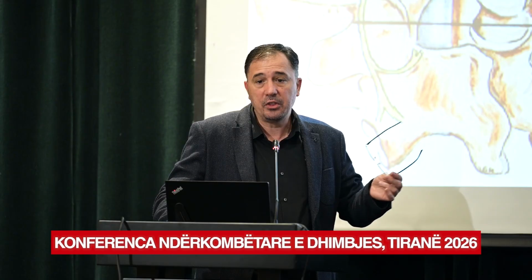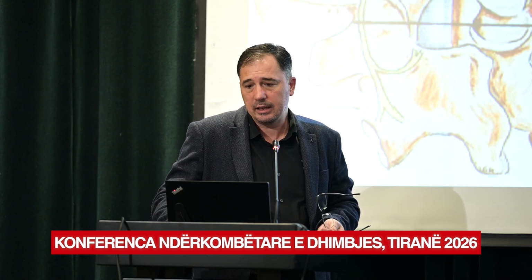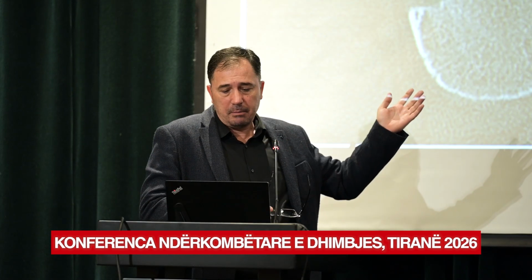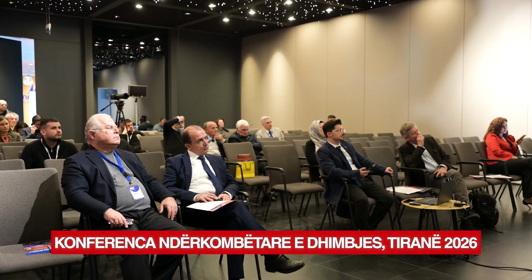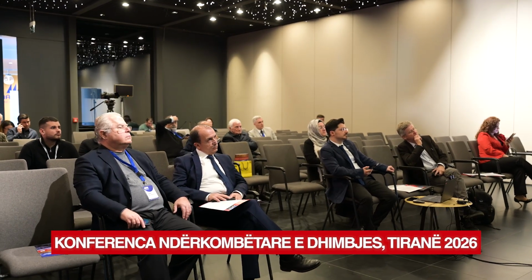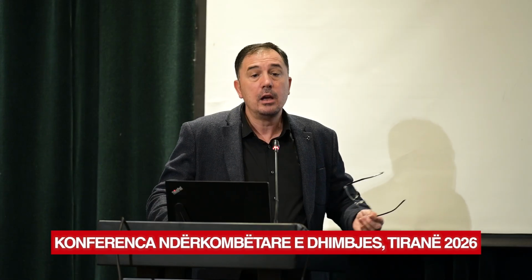And this is very important for radiologists to know before making these procedures. So this is an example. It is very simple for us, with the patient in the CT scan, to put the needle and to inject inside the facet, and these are images that we are familiar with in our everyday work.